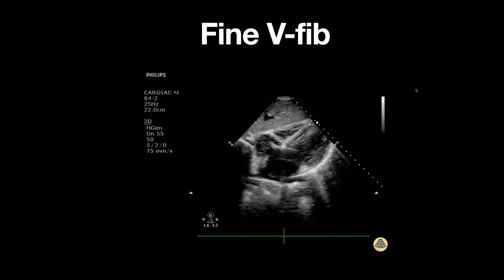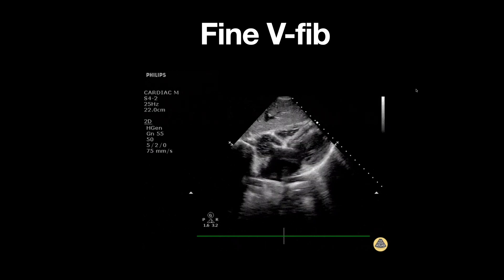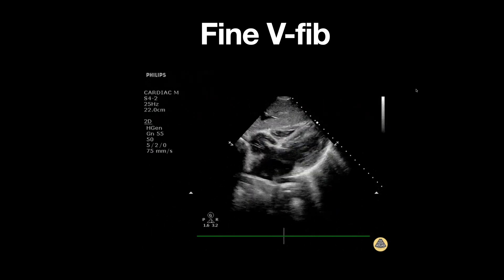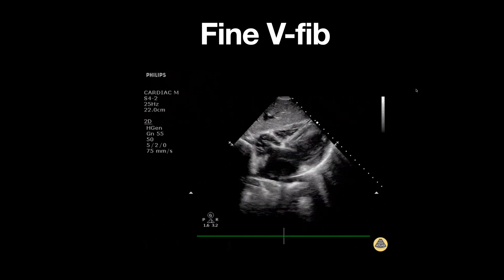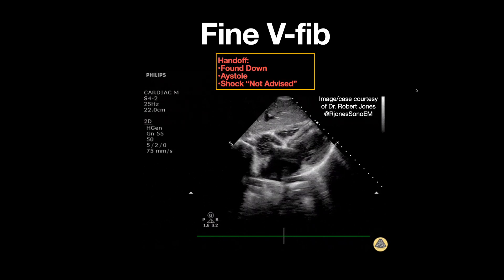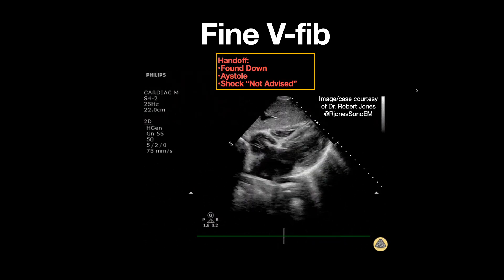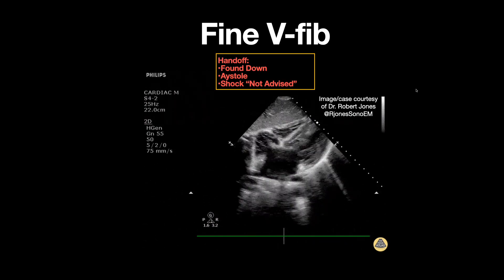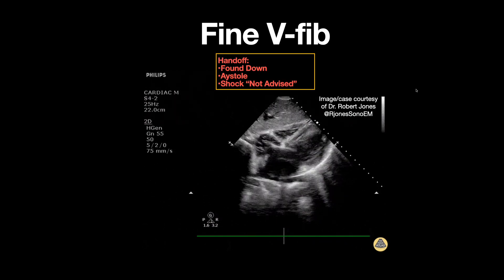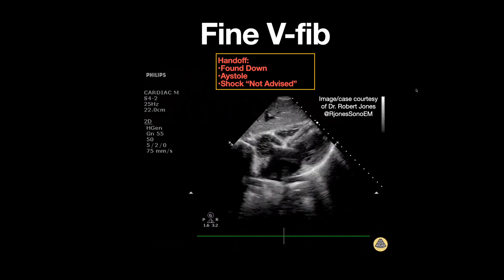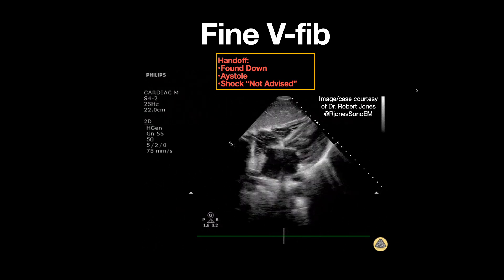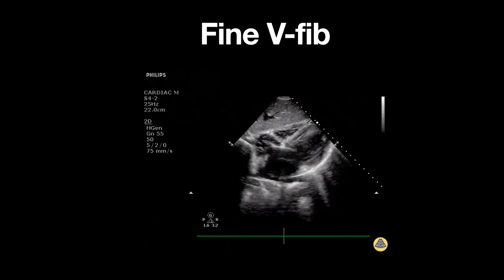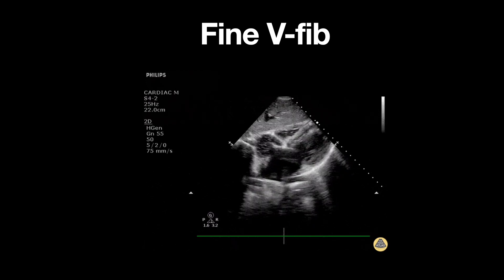This is an ultrasound clip demonstrating fine ventricular fibrillation seen during a pulse check in cardiac arrest. The patient was brought in after being found down and was noted to be in asystole in the field, with the AED indicating that a shock was not advised.